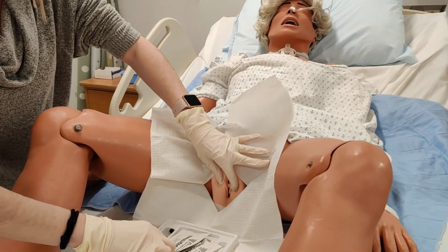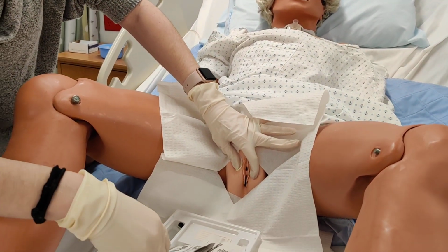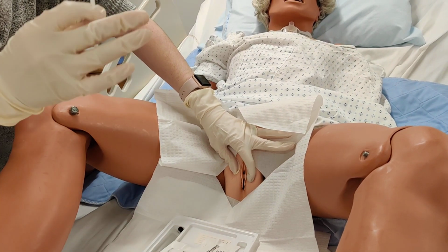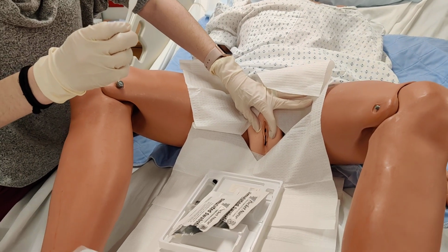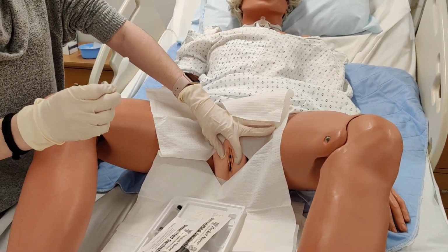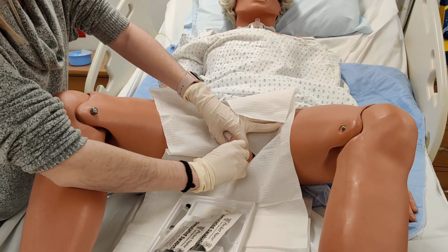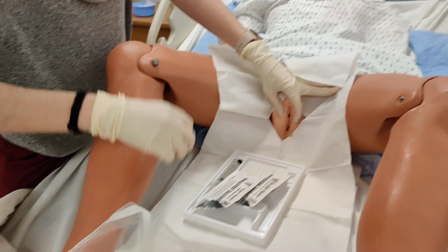All right, once the labia is spread, we can really visualize that urinary meatus. She's going to cleanse the area. So she's going to take out 1 swab stick, and the labia furthest away from her, she's going to go top to bottom 1 swipe. And that will be tossed.